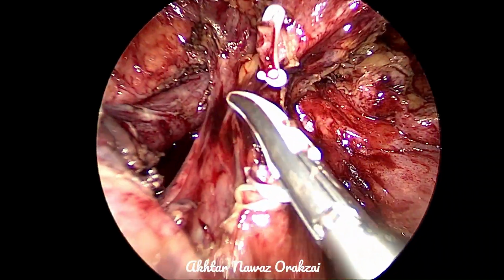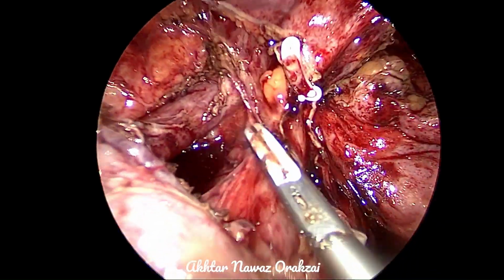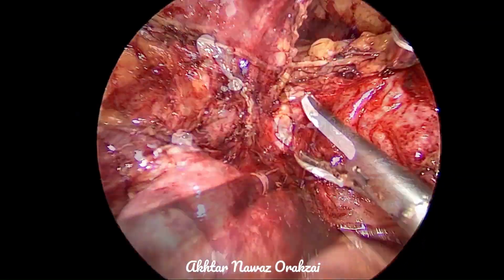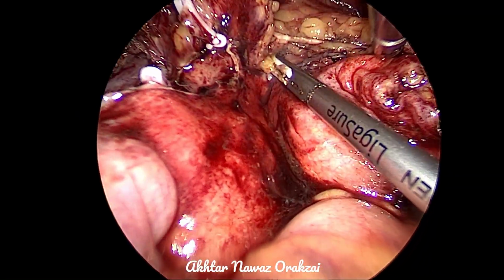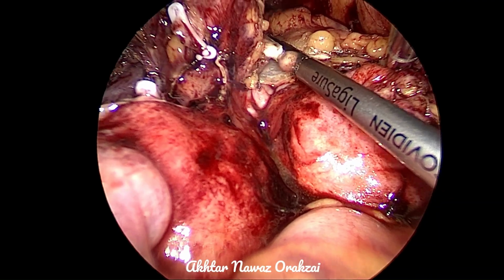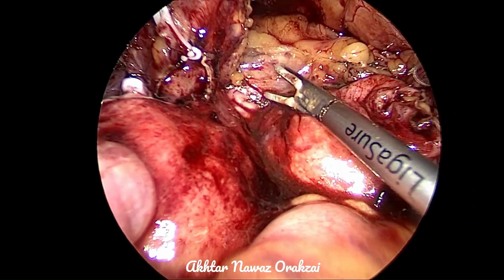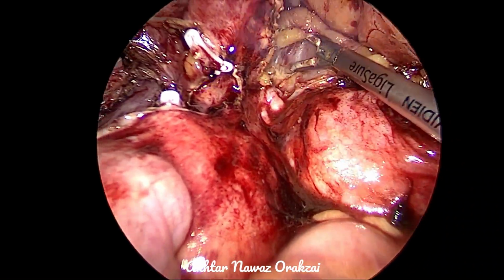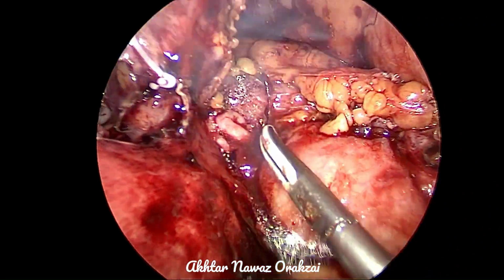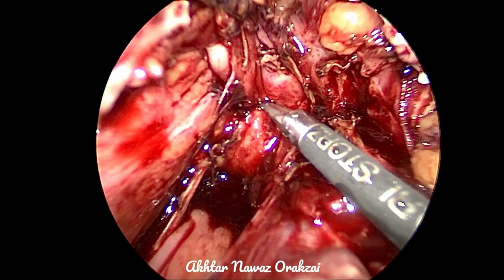A little bit of fibrotic tissue is again coming into our way, that is being taken down as well. Here you can see the obliterated artery, the umbilical artery, that is properly coagulated at multiple sites with the vessel sealer and then cut. So slowly and gradually taking down the attachments of the bladder and the perivesical area, the bladder will be mobilized.